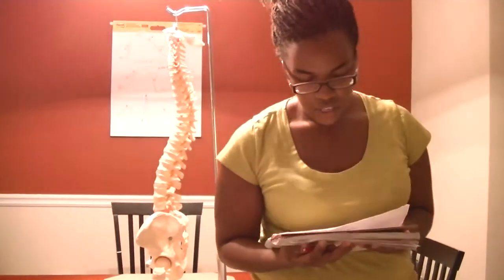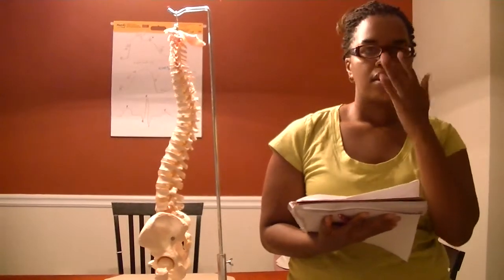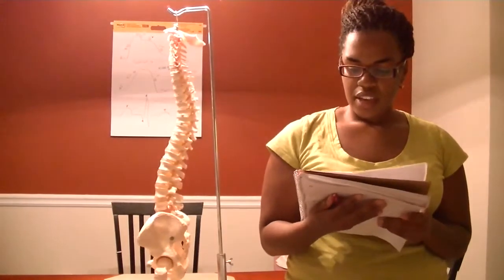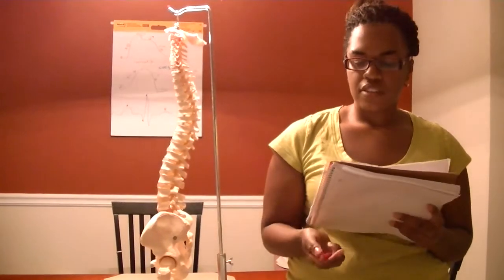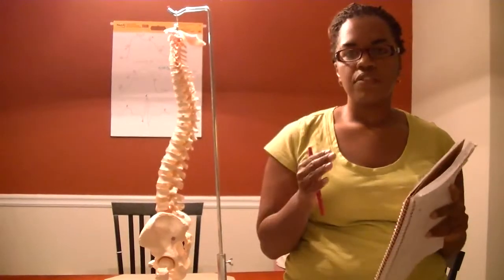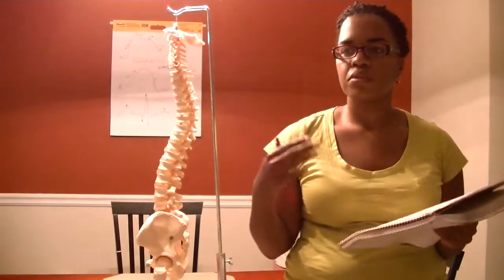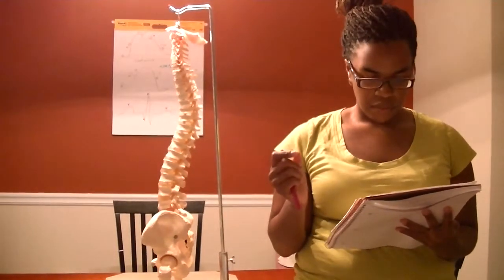In adults, if our ADI is greater than 3, then that most likely means that there's an issue of rheumatoid arthritis, which causes a laxity in the transverse ligament. And in children, it'll be manifested as chronic bacterial infections. And what happens is the fever that children experience by having multiple chronic bacterial infections or ear infections is going to cause that laxity in that transverse ligament.